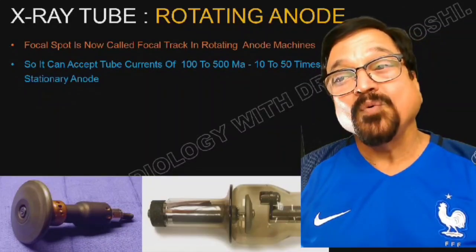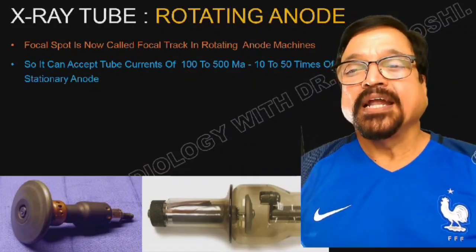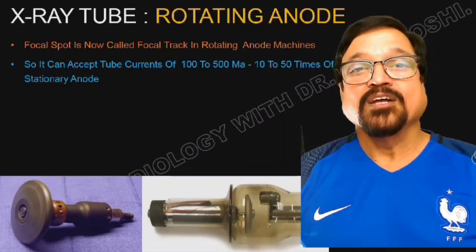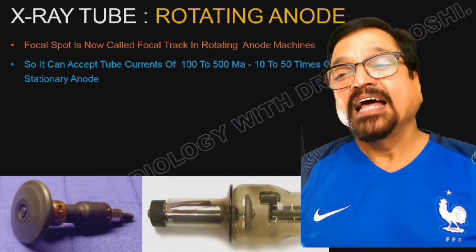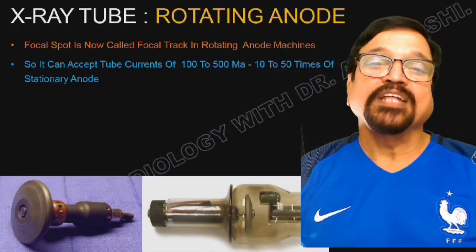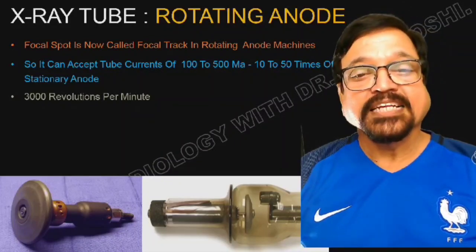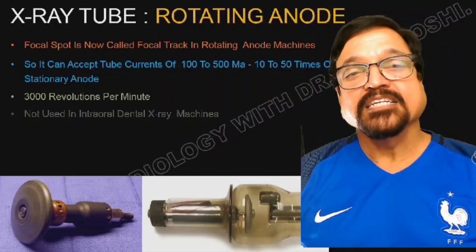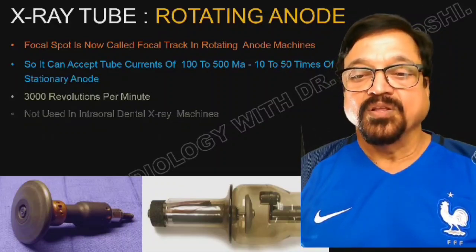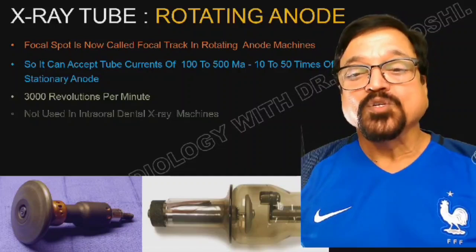Now see how the tubes are designed. You can see the focal spot is now called a focal track because it is moving. So it can accept tube current up to 100 to 500 mA. So it can work at a higher mA, that is 10 to 50 times that of the stationary anode tube. Then 3000 to 3600 revolutions per minute is the speed in different machines.